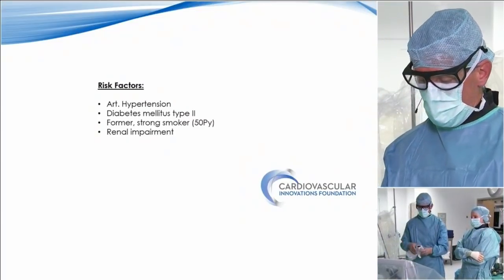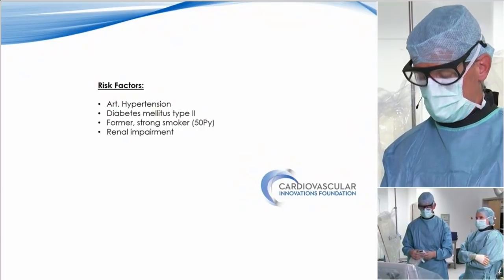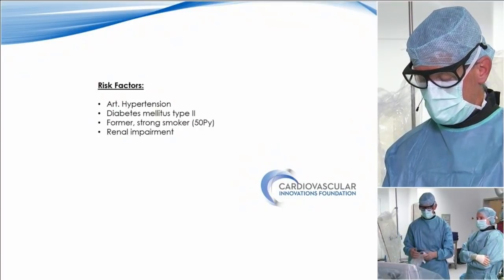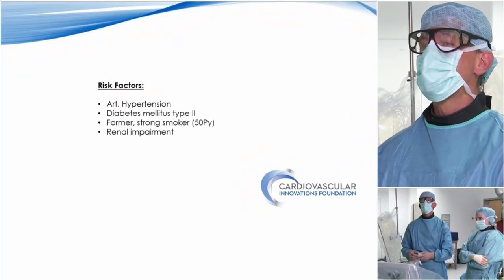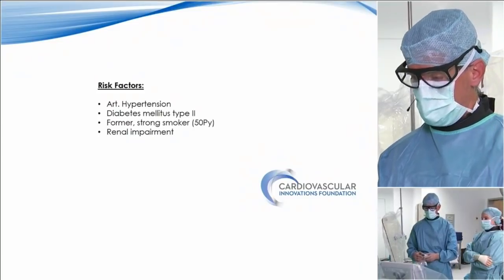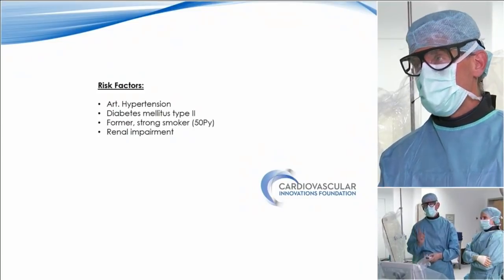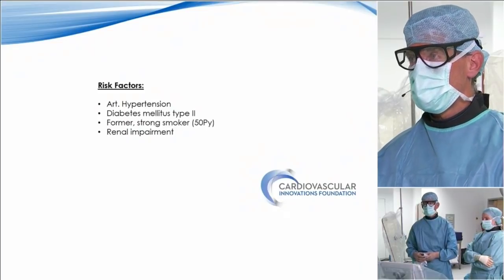So, Andrej, being a surgeon, really, if we do use the SFA proximally, we usually lose about 10 centimeters almost, and we clean it from all calcium, so you will not see it. But if it is not being used as a patch, usually we ligate it.